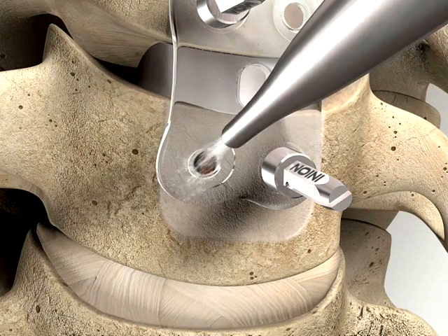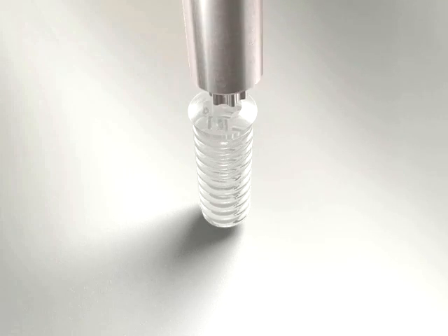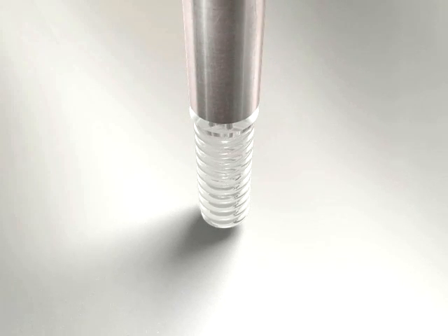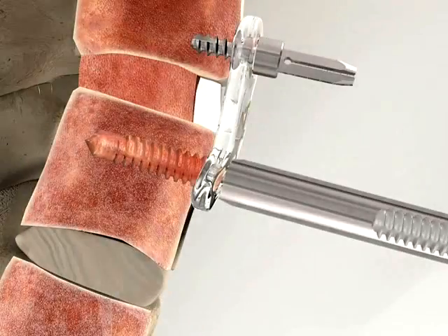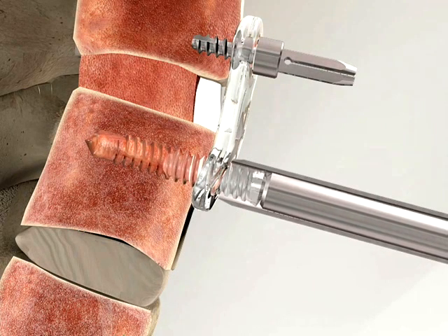Remove the temporary fixation screws and insert the final screws using the Inion screwdriver. A squeaking noise can be heard when the screw is locked to the plate. Continuing to turn the screw after this point will risk stripping the screw socket.